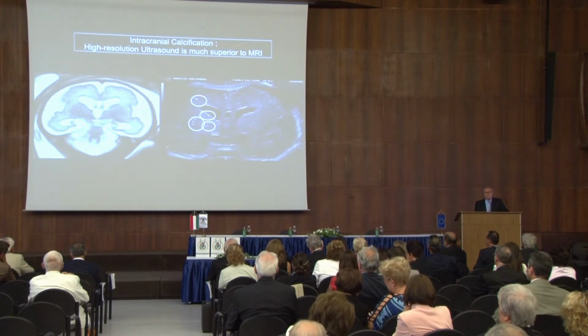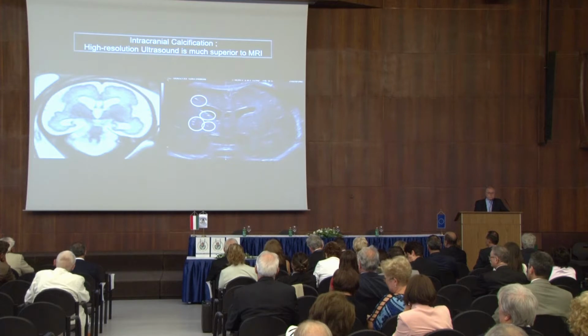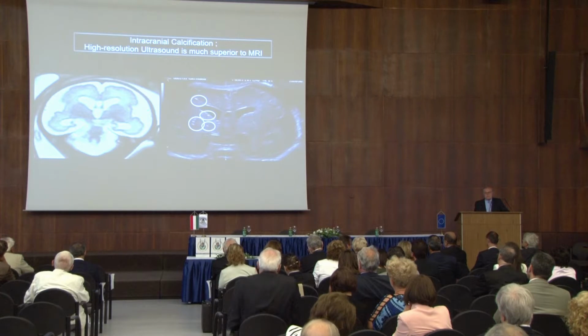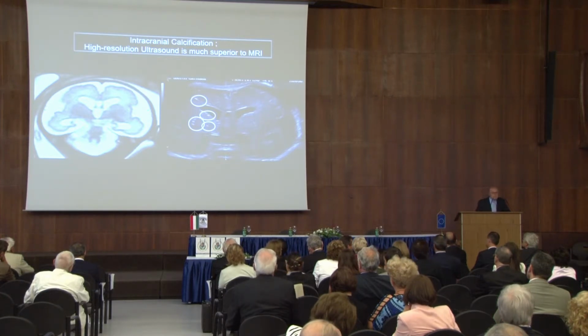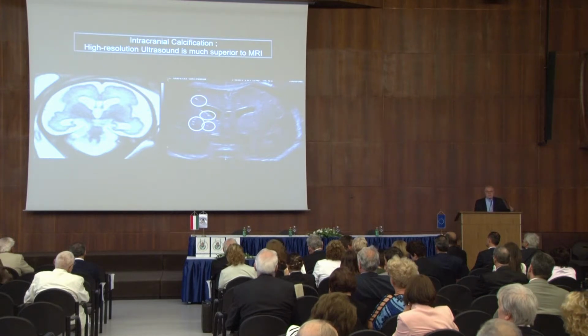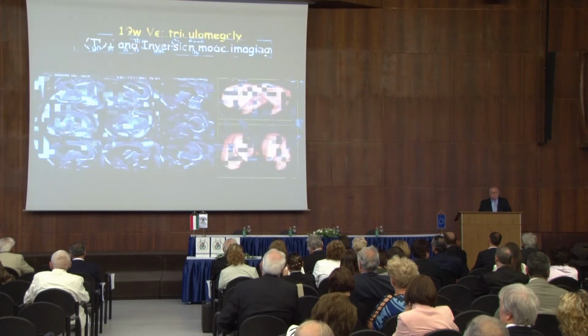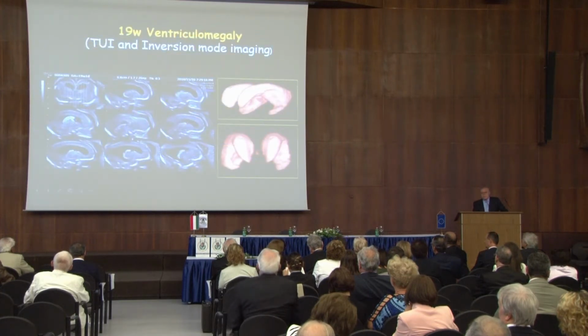But this slide tells you more than 1,000 words. In the present controversy on the use of either 3D ultrasound or magnetic resonance, this picture is very convincing. To be very honest with you, last year I used magnetic resonance only once in a large scale of patients. Magnetic resonance is needed when ultrasound is not good. 3D ultrasound and magnetic resonance were both born 30 years ago, so any comparison for journals about the value of ultrasound must go back 30 years to combine 3D ultrasound and magnetic resonance.